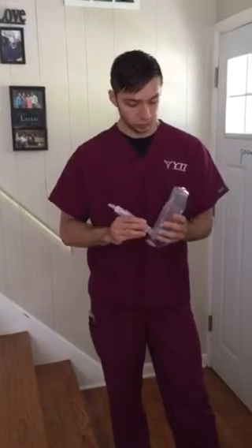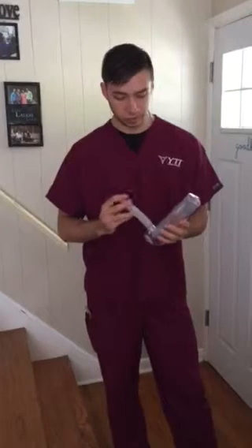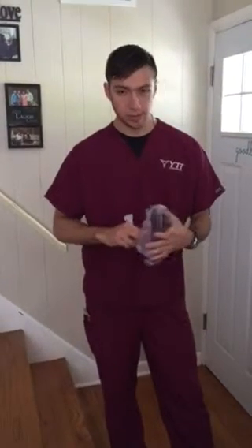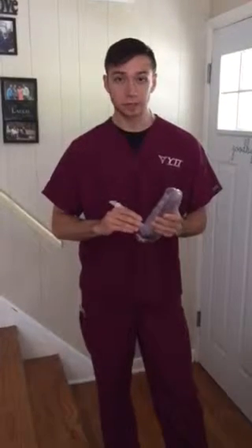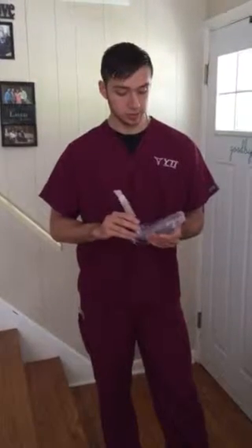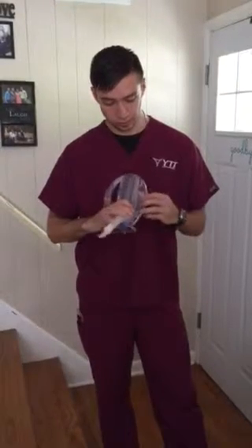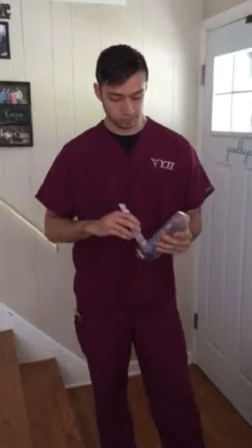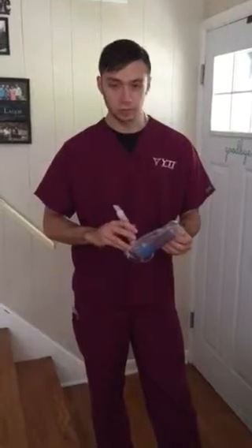It's very simple. I mean, kids can do it, or elderly people can do it. It's just important to take slow, deep breaths, not to wear yourself out, and you want to keep this little ball between the lines on the side. If not, the patient is doing it incorrectly, and they're often going too fast.